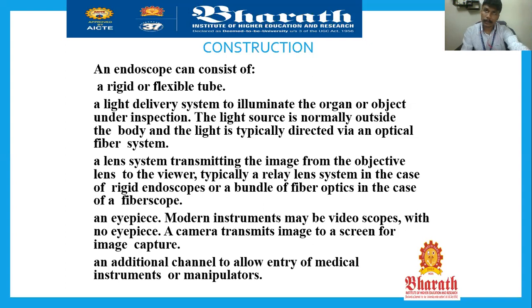Why is the endoscope made of fiber optics? It means the material will be lighter and flexible, with the ability to change its structure according to the need and demand of the internal organ architecture. For that purpose, fiber optics material is used for making the endoscope.